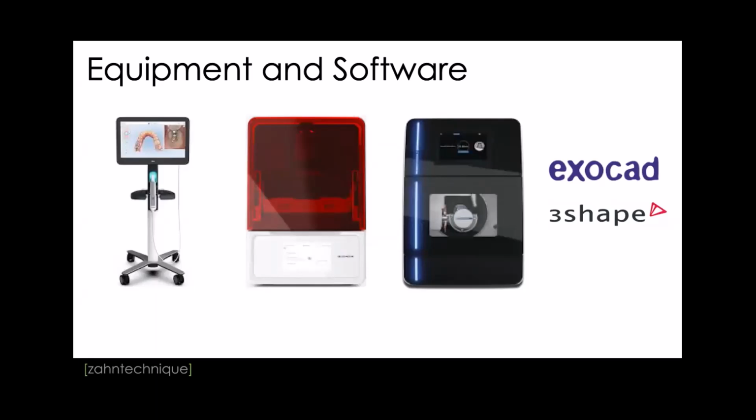And I would say, especially over the last 2, 3, 4 years, intraoral scanning definitely made a huge step into the whole digital era, digital workflows in dentures, in removable dentistry. Then in combination with 3D printing and also milling, of course, but we already had that, and especially the advancements we see now in CAD/CAM software. Two of them, like 3Shape and exocad, are the biggest ones. There are many others out there, of course, smaller software companies, but everybody most likely knows exocad and 3Shape.